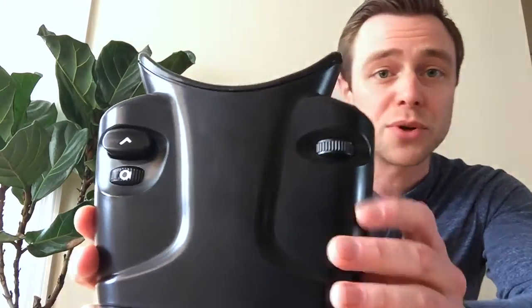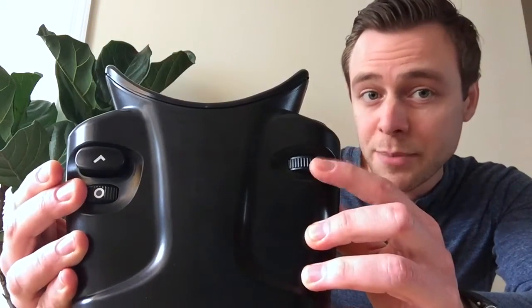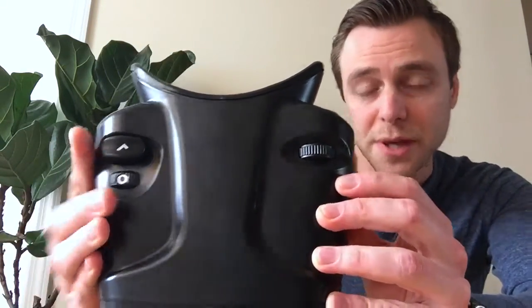The device has three very simple controls: a brightness knob on the right, an alignment knob on the left, and a selection button. When you look inside the device you're going to see two umbrella-like shapes, one red and one green.